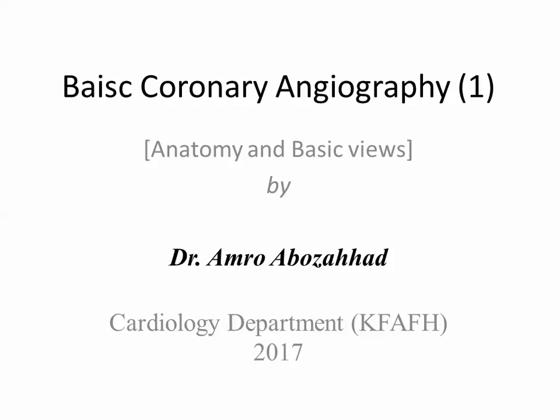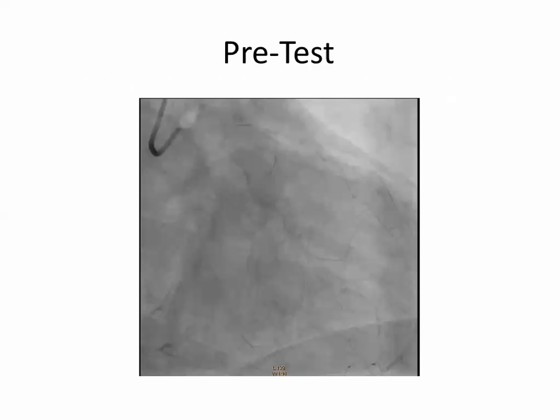Basic Coronary Angiography Part 1, Anatomy and Basic Views.